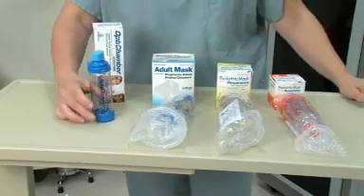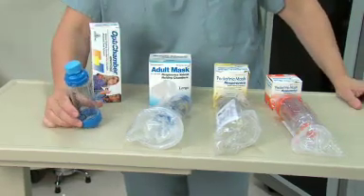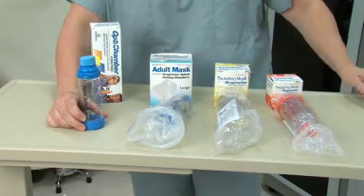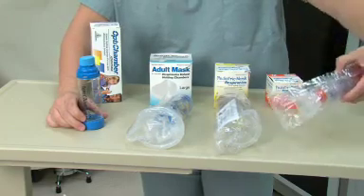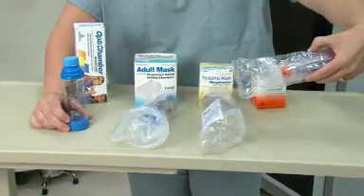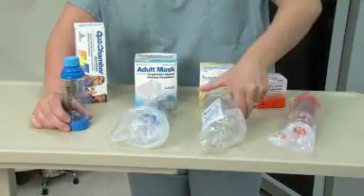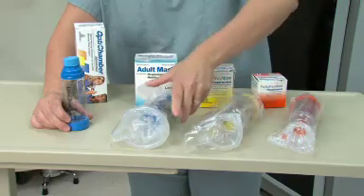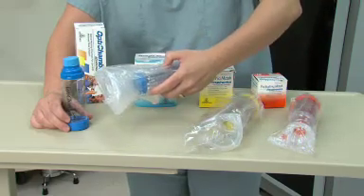And on the front side, we see that the AeroChamber group have decided to go with merging and incorporating the mask with the holding chamber itself. So we have a neonatal mask and holding chamber, a pediatric mask and holding chamber, and an adult mask and holding chamber.